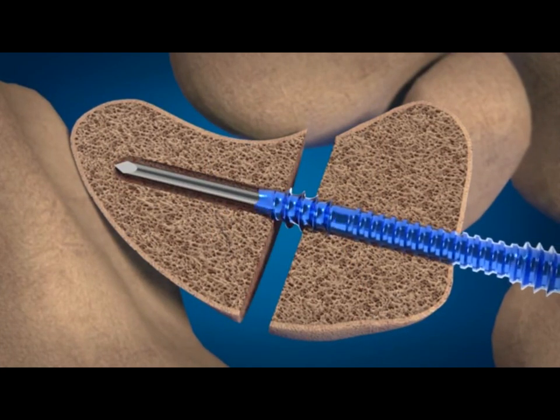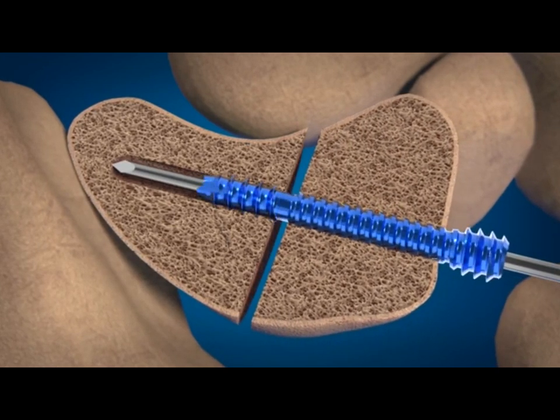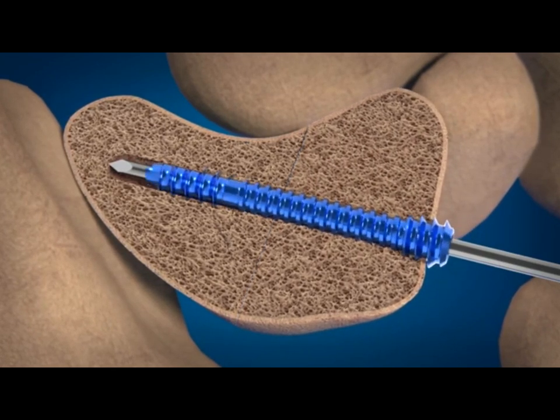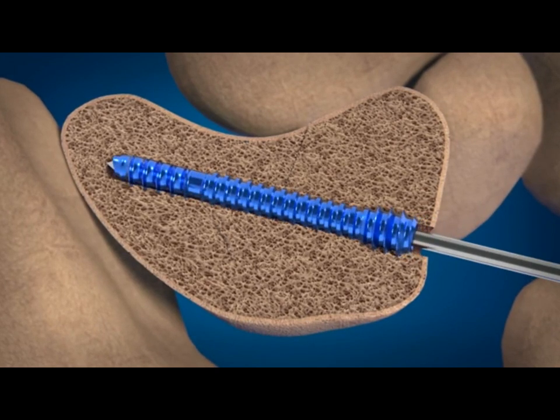When the screw pauses advancing, notice that the special clutch feature of the screw prevents over-compression of the fragments during insertion. When the screw begins the final advancing, final compression occurs when the trailing threads engage the near cortex and provides one millimeter of controlled compression.